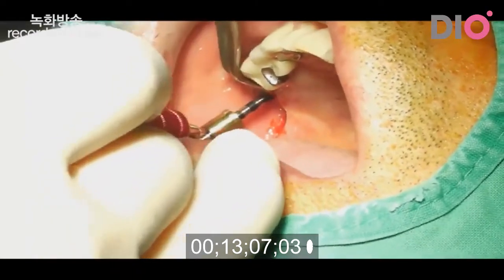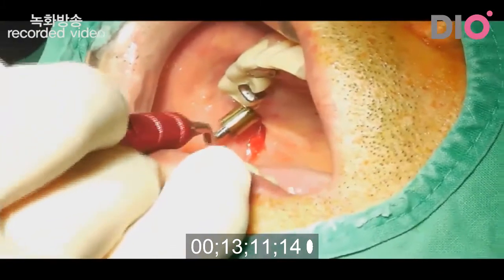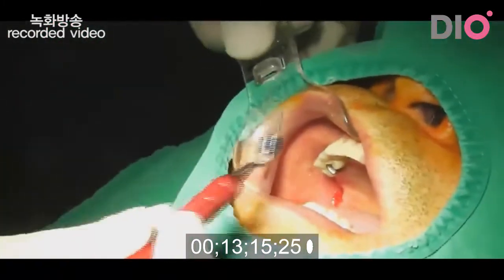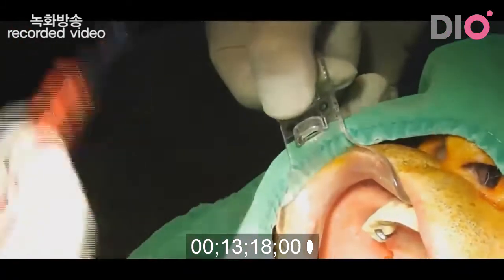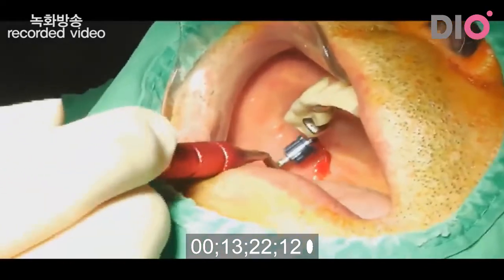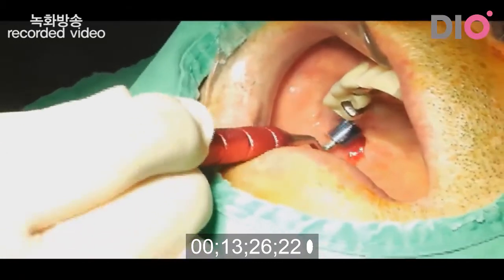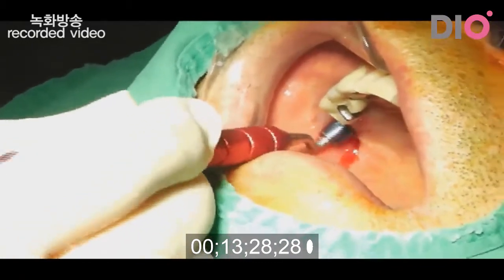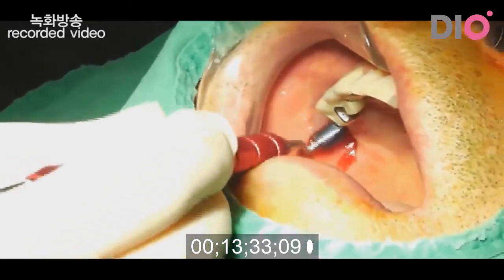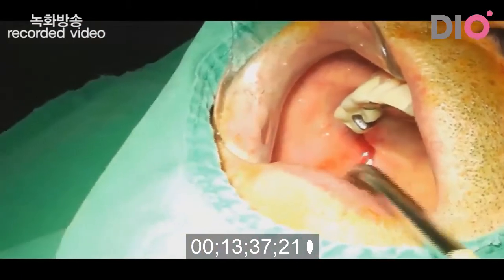Okay, and then after inserting the half of the material, I use this curette to distribute, to spread the sponge in the sinus cavity. So I try to spread the collagen sponge evenly in the sinus cavity. Okay, and then another part.